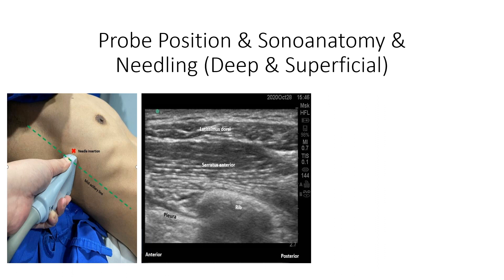The sonoanatomy we are looking at includes the latissimus dorsi, the serratus anterior, and the ribs — most likely the fifth rib corresponding to the nipple level — and also the pleura, which we can see sliding on top. For needling, the needle length depends on the depth from the scan. For this patient the depth is around 2.5 cm, so the needle should be less than 50 mm. For a larger patient, a longer needle can be used. We insert the needle in-plane, aiming towards the ribs to avoid any pleural puncture, then deposit the LA on top of the rib. This is the deep SAP block.